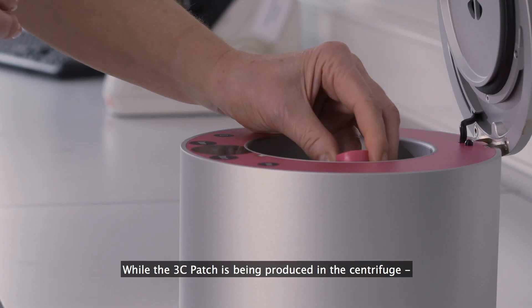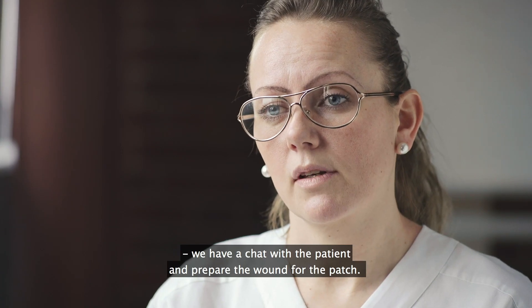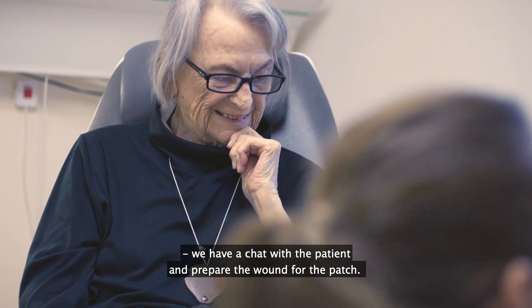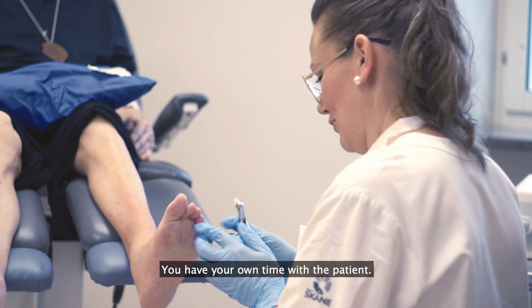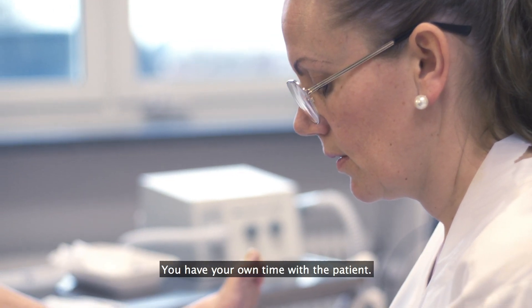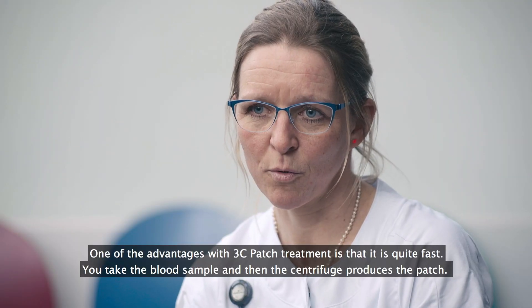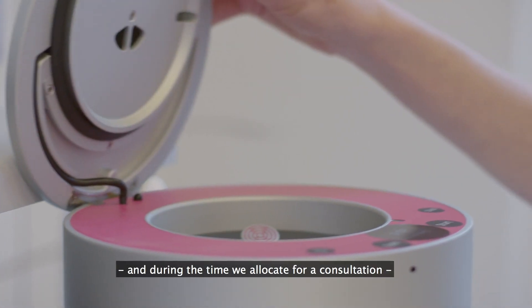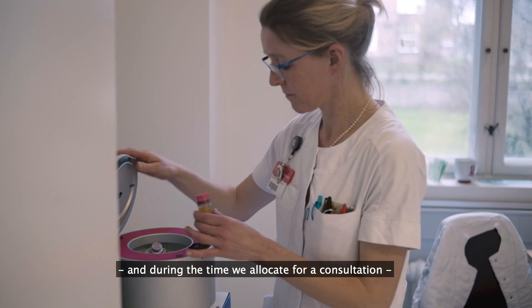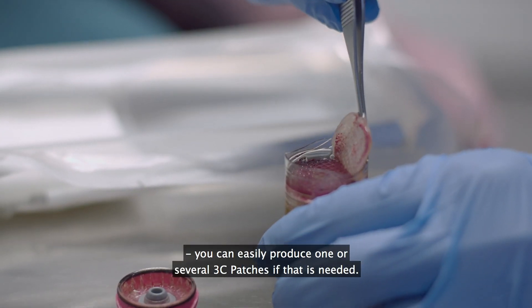During the time that the 3C patch is in the centrifuge, we are talking with patients and also preparing the ulcer. You revise, you prepare the ulcer. So you have your time with the patient. The advantage of the 3C patch is that it doesn't take very long. You take the blood, then the centrifuge runs, and while it's running, you can do something else. So in the time we'd normally spend on a standard treatment, you can do a 3C patch treatment, or more, if needed.